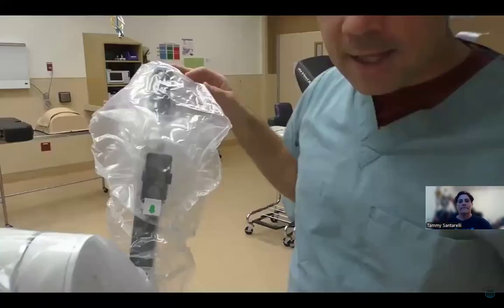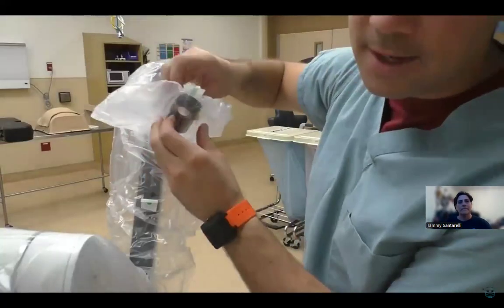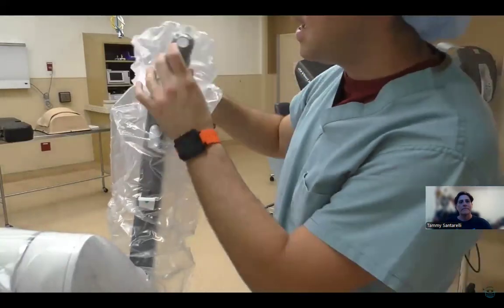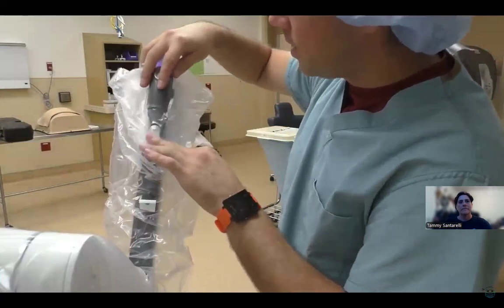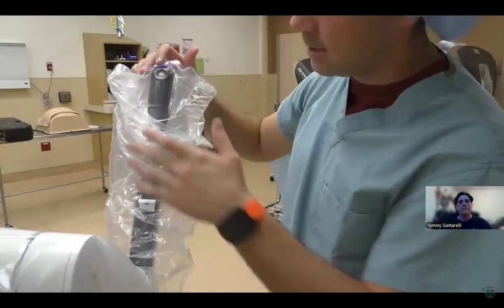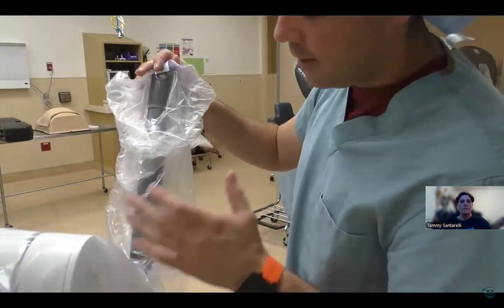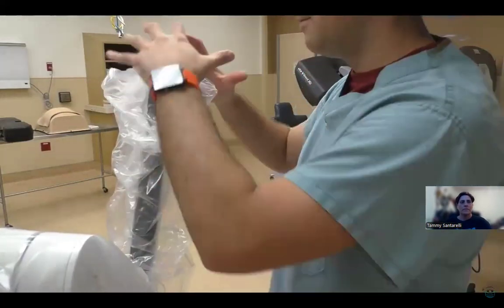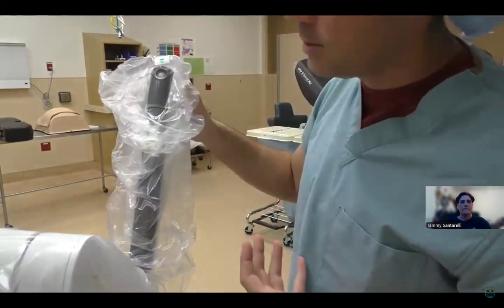Last part of this draping is this plastic piece that's on the back side of the drape. It's just going to slide and clamp in. Remember, try to keep the plastic out of the way. And it's just going to clamp in place to try and keep some of that slack out of the drape itself and keep it down instead of bunched up over where you're going to be inserting instruments.